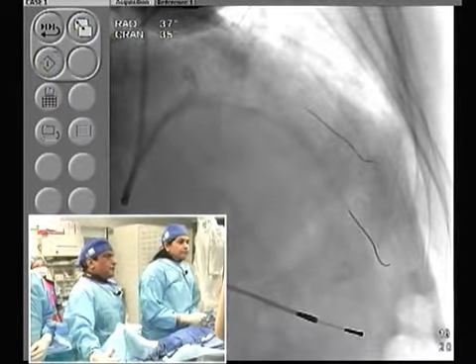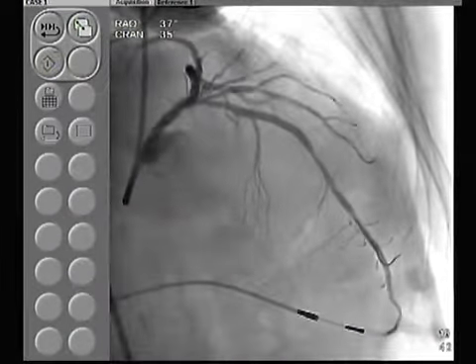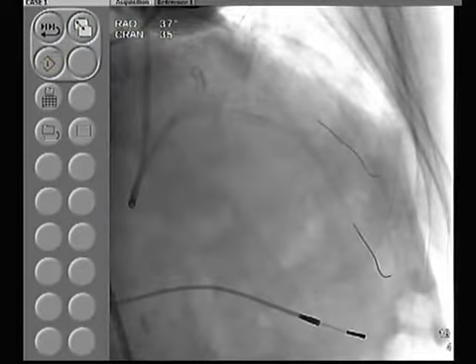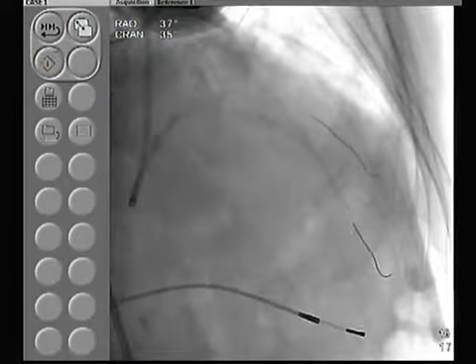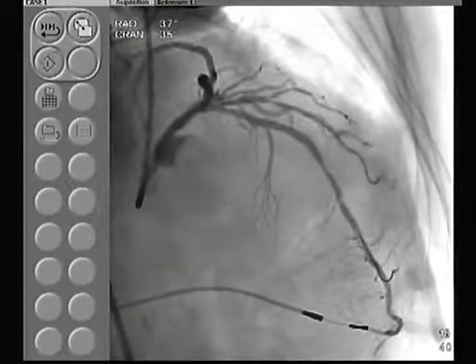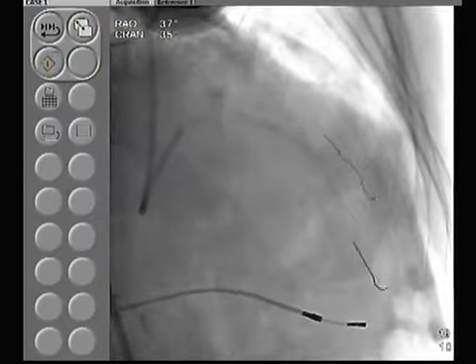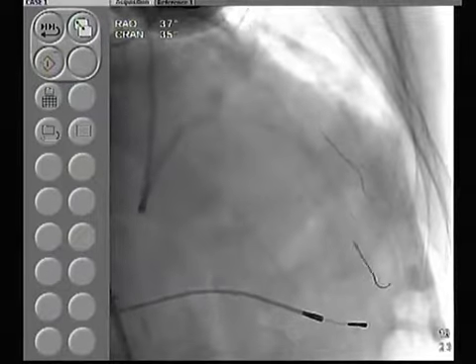Do we put two stents in the diagonal? I would just dilate the mid segment with the 2.5 balloon. I think the 28 will cover it. You want to do a V. But will it come all the way up to 2 millimeters into the main vessel? No, the 28 may not come all the way. Let's get a 2.5 by 28 Promus. We should have started right.